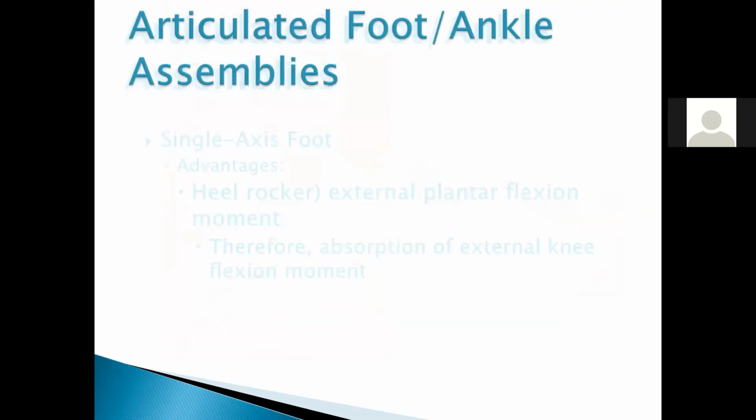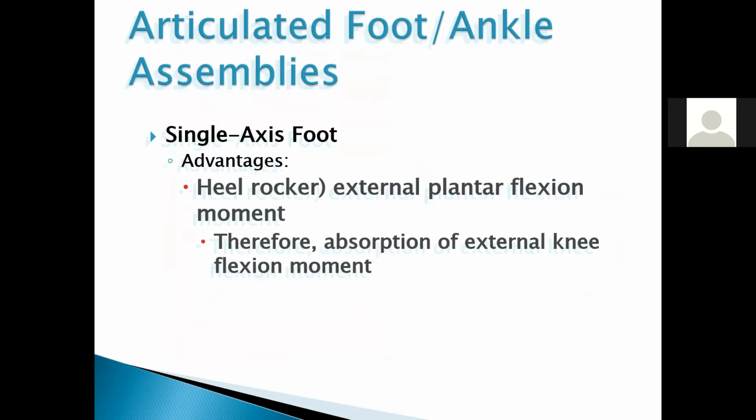Okay, so in the next few minutes, we're going to start talking about some of the jointed or articulated foot assemblies. And the most common is the single axis foot. So we've been talking about this before when we were thinking about the SACH foot.